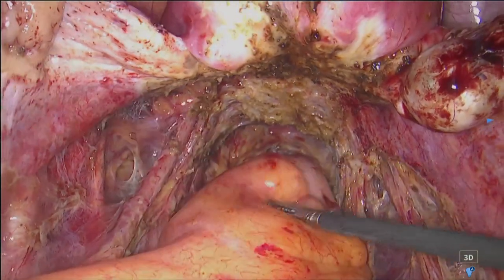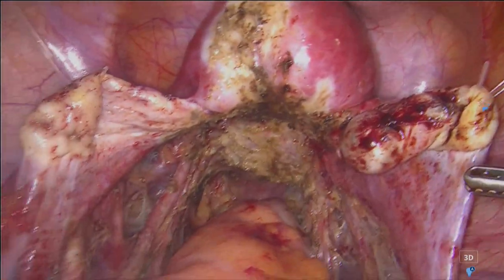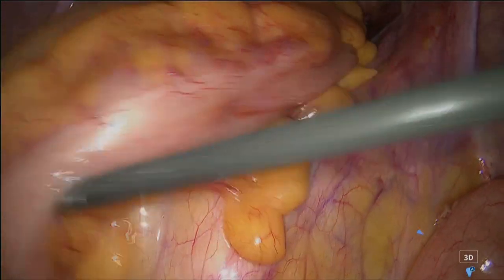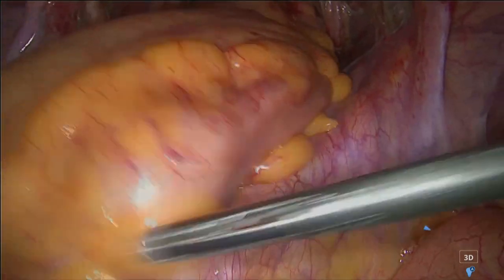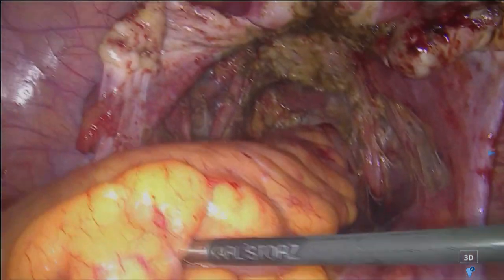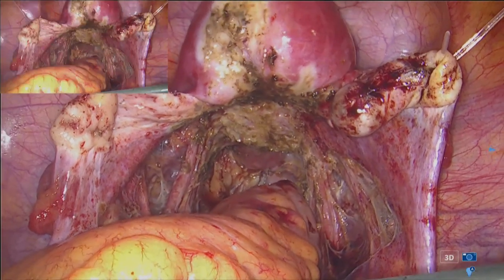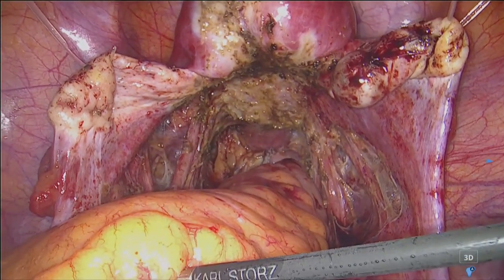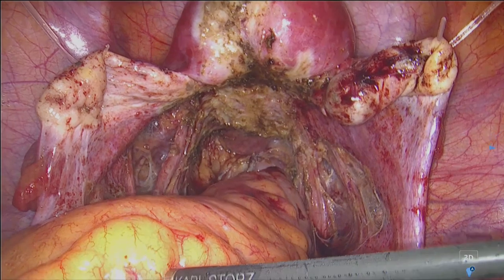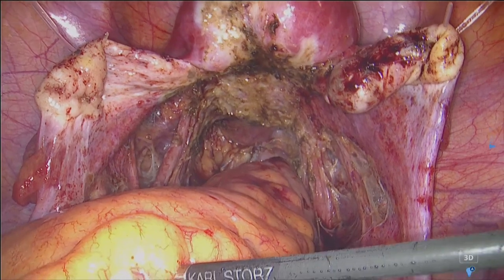And so now we can ask Valeria, the nurse, to inject the indocyanine green intravenously. And so we can check the vascularization at the level of the anastomosis. And so, thank you to Ida Oppido, the other anesthesiologist of today. Then it remains to treat the right ovary with the laser and to show you the specimen, the rectum and the sites of the nodule.